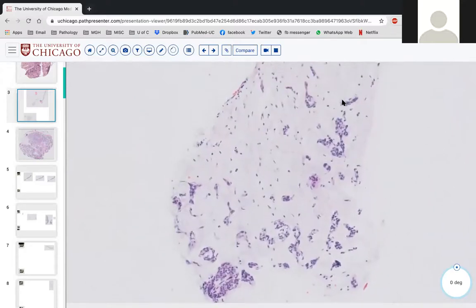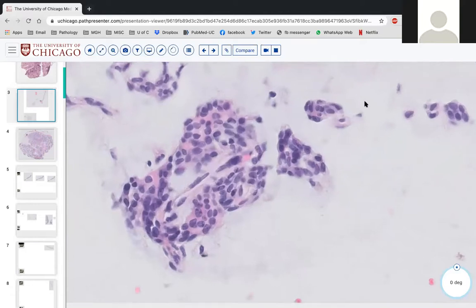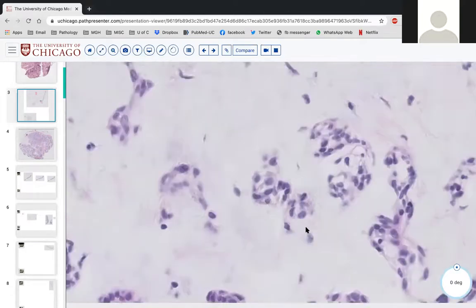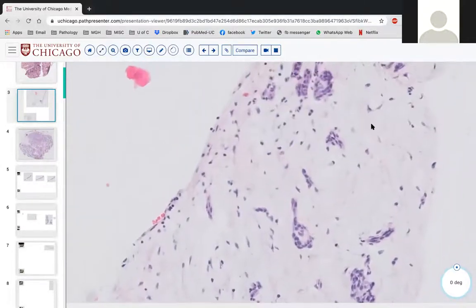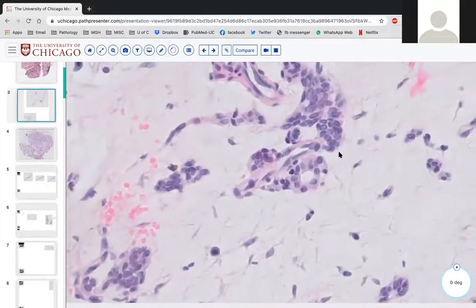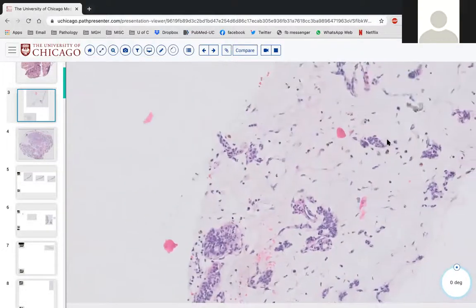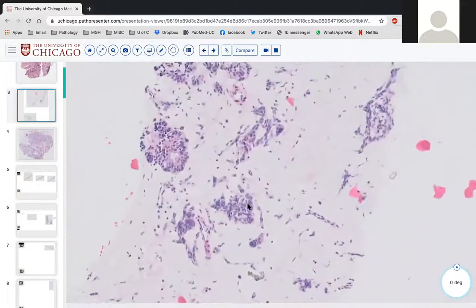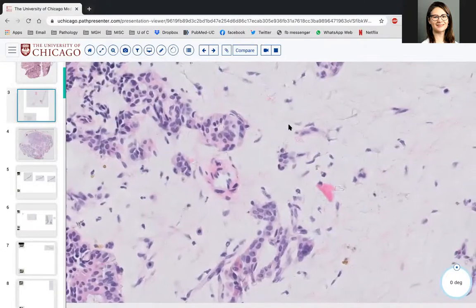And then the cells themselves, sometimes they have a spindled morphology, completely single, and sometimes more epithelioid, almost duct forming, usually bilayered, in a couple areas, maybe the same but in a different section through it, like cross-sectional versus longitudinal sectioning. Yeah, there's some maybe plumper epithelioid cells, maybe surrounded by a second layer of myoepithelial cells. Okay.